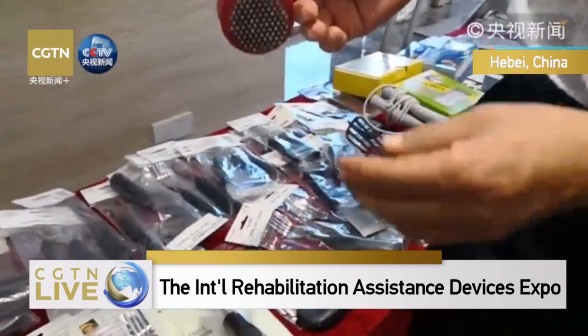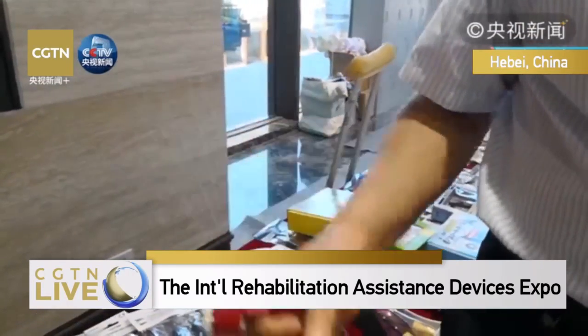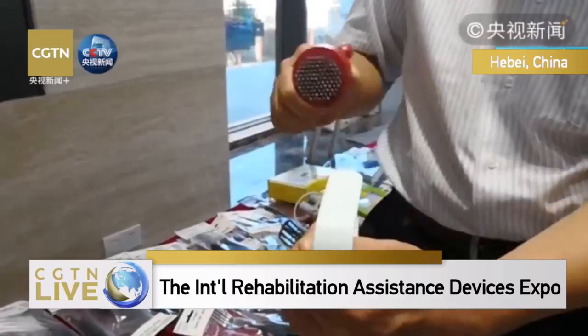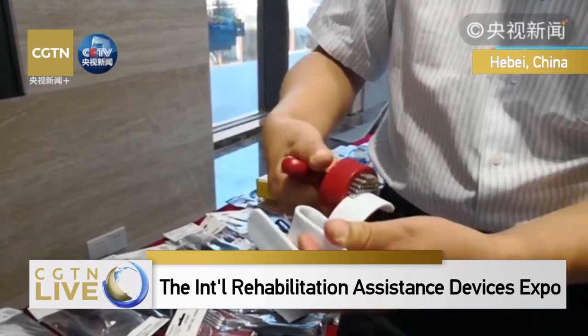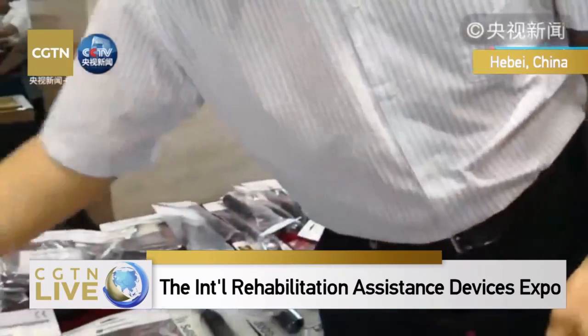You might not know what this is for. It is used for turning things. For example, if this is a key, if you do not have enough power in your hand to turn the key, you can use this to assist you.